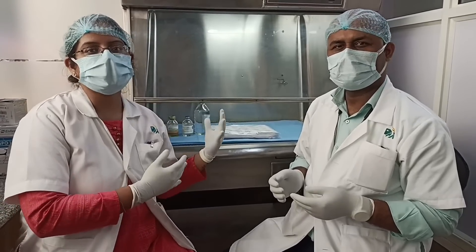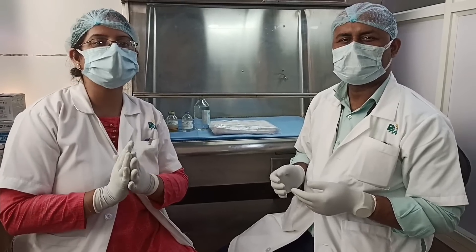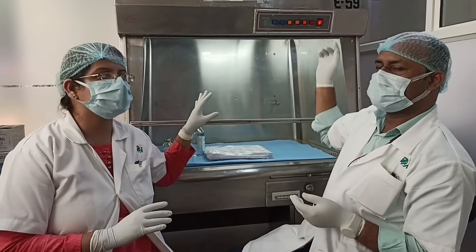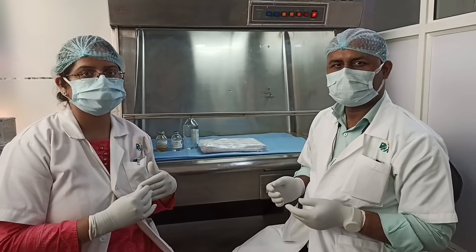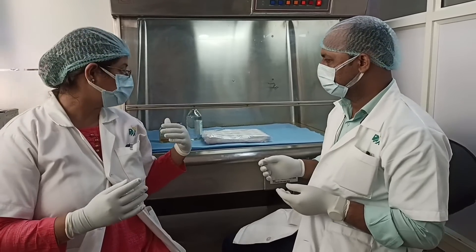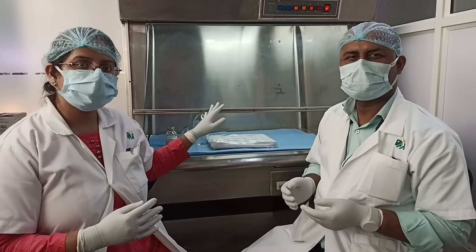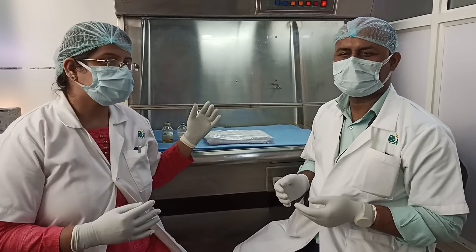Now we will be demonstrating how to prepare the solution. Before preparing the solution, we have to ensure all the items are ready beforehand. We need to switch on the laminar hood — as you can see, we had already switched it on. It needs to be switched on with the UV light for about half an hour prior to starting the preparation. This ensures asepticity is maintained. All items are thoroughly sanitized once again right before starting the procedure.